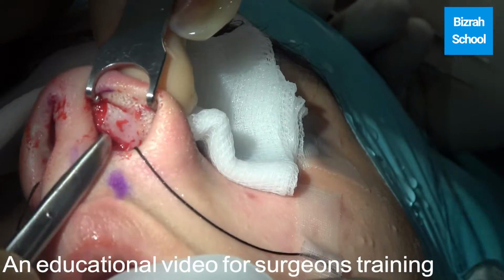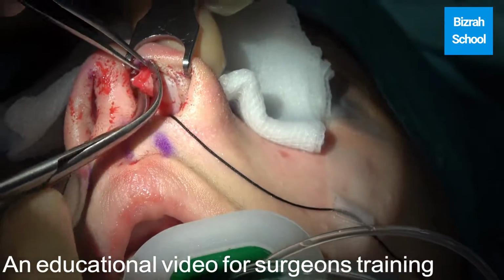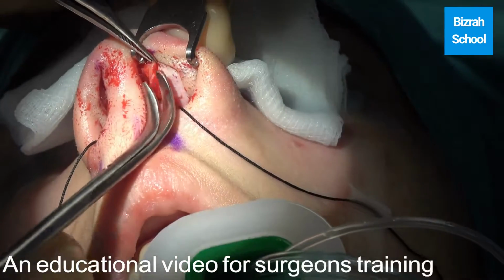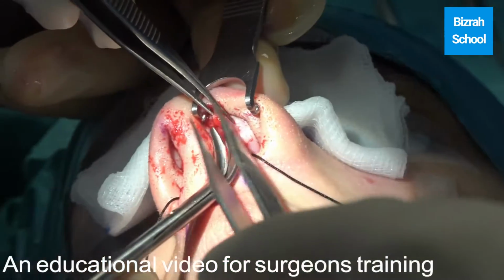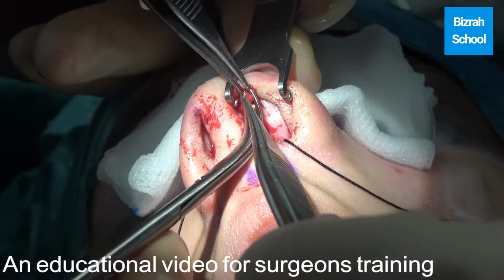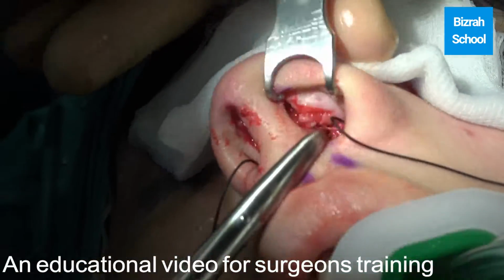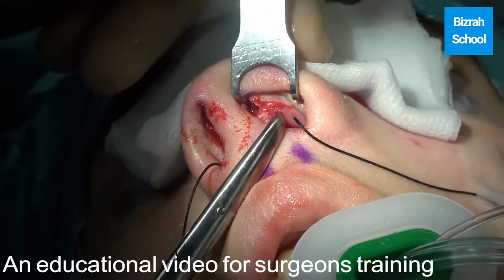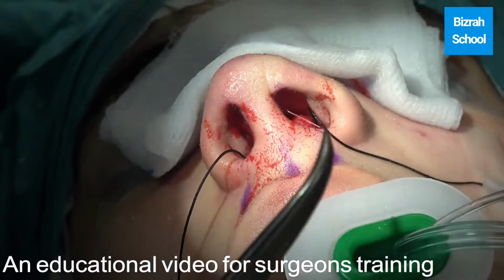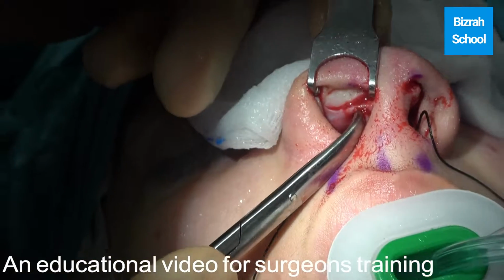Lateral crus on the other side. Again, it looks quite nice. You just get rid of this sharp edge here. Okay. We get this sharp edge off. You see, very nice lateral crus in place, and you see all the cuts are coming together. So this will heal within a few days, mucosa to mucosa, as you see there. And there, if you look, you see again the mucosa to mucosa.